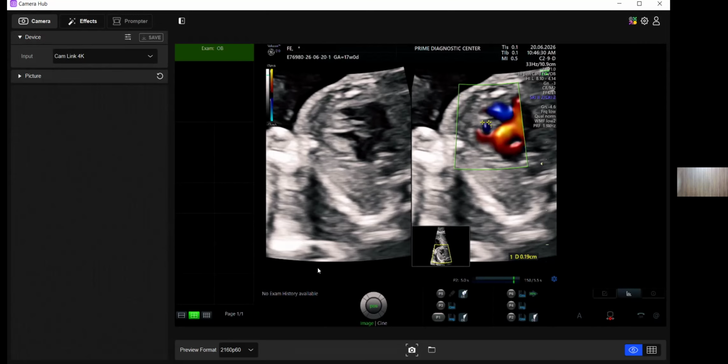You wanted to know about the clockwise rule, and it would remain the same wherever you put the position. Pointer depends upon the fetus position. Once I'm doing a scan, my pointer should be on the left side of the fetus.